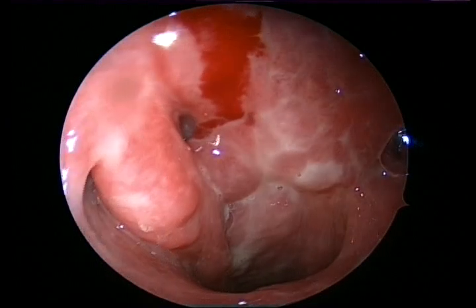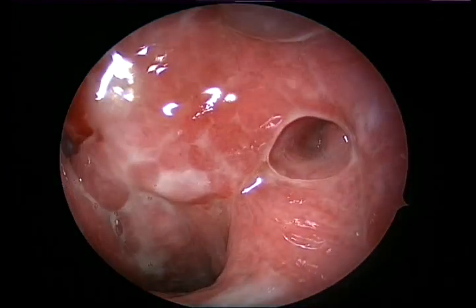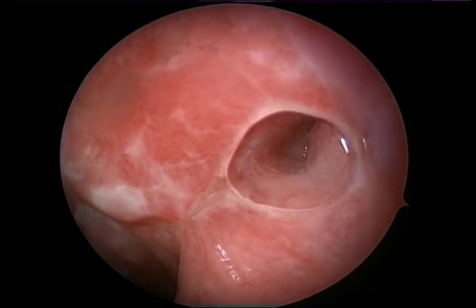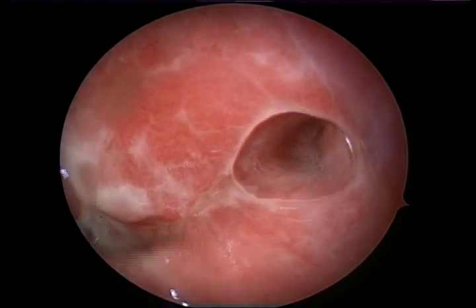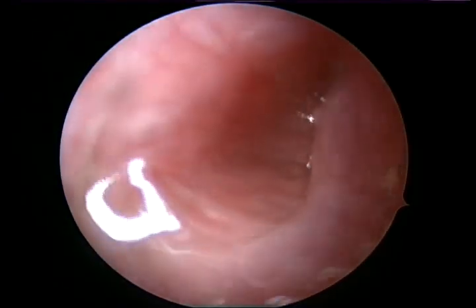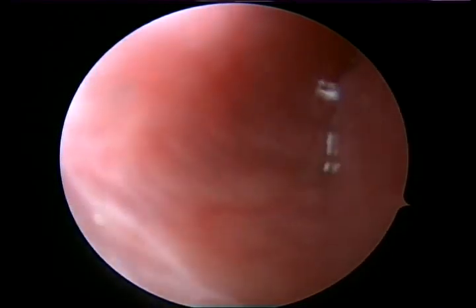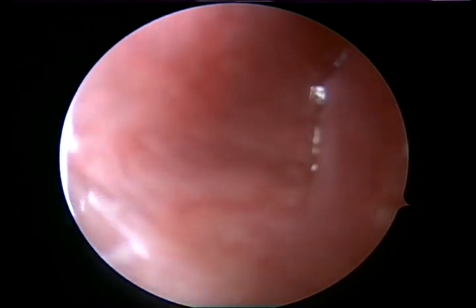You can see that the eustachian tube has been dissected on the left side. On the right side you can see the tubal elevation. On the left side, we have cut the cartilaginous portion of the eustachian tube. What you're seeing is directly the bony portion of the eustachian tube, and you can see that opening when the patient swallows. That's the bony-cartilaginous junction.